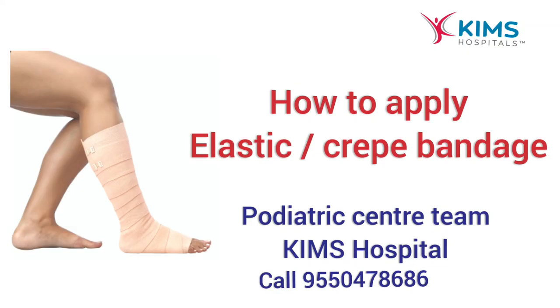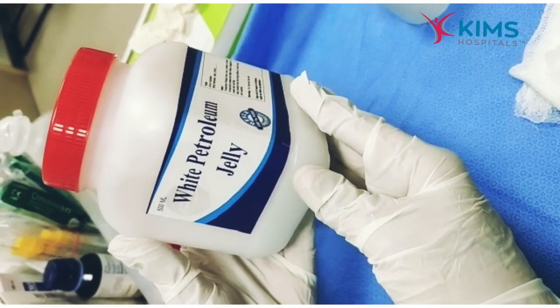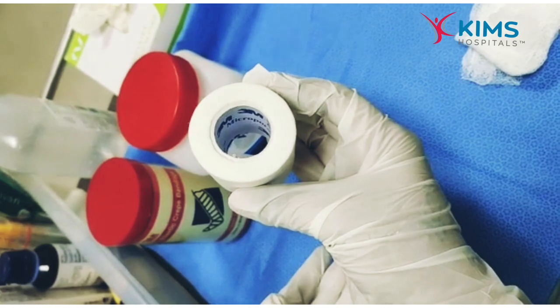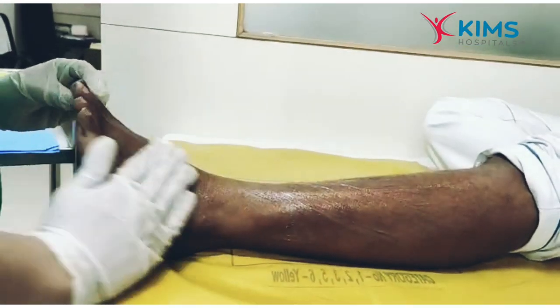Now we will show you how to apply a crepe bandage. You will need a crepe bandage and Vaseline or any moisturizing cream. Crepe bandage is generally advised in patients who have varicose veins, lymphedema, or leg swelling conditions.